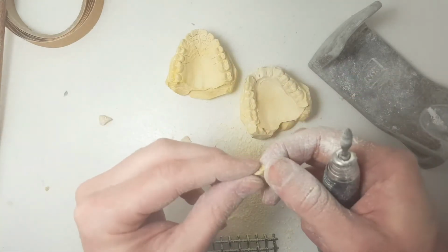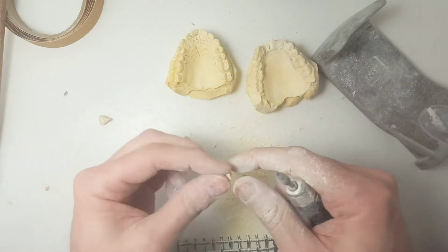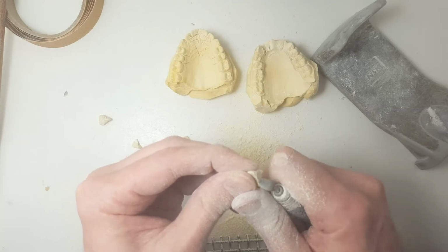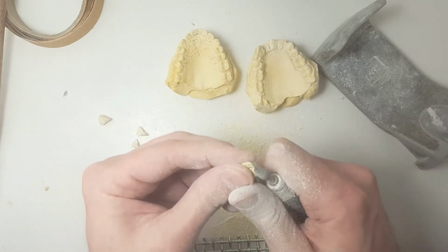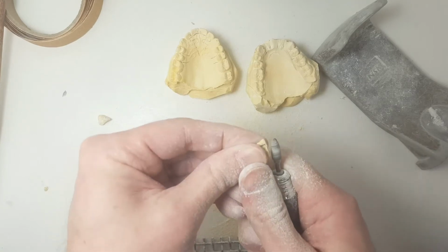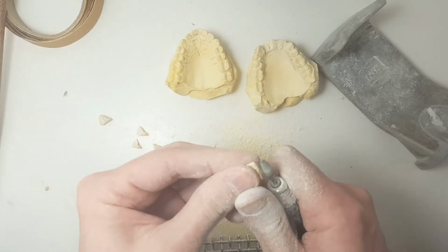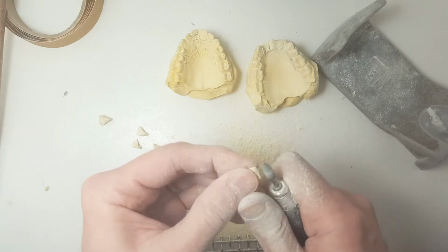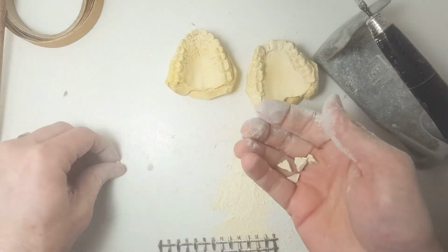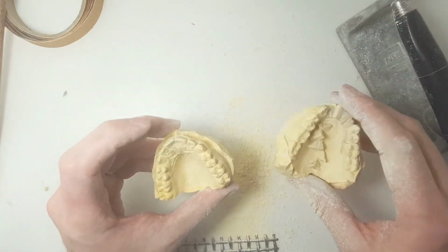I may not have to do it on all of them. Right now I'm not dealing with a lot of rotations, but if I was, these are mainly just pushing out and rounding out. Again, I'm just holding it at an angle, not touching this part with my burr. Alright. So I'm not going to cut this one out yet. I'll come right back to it.